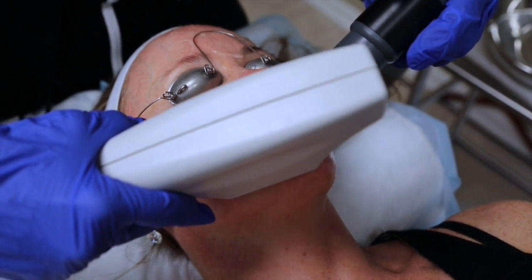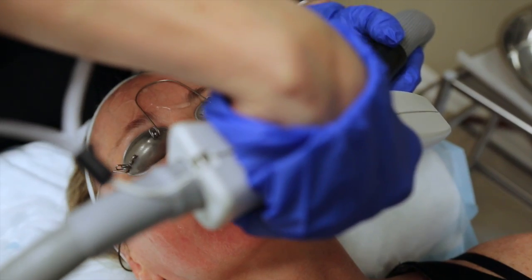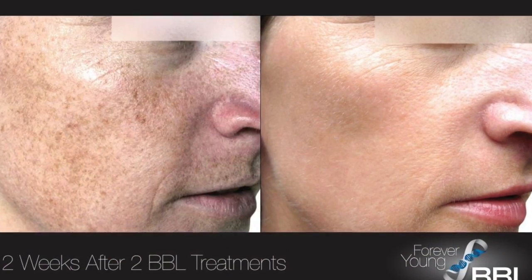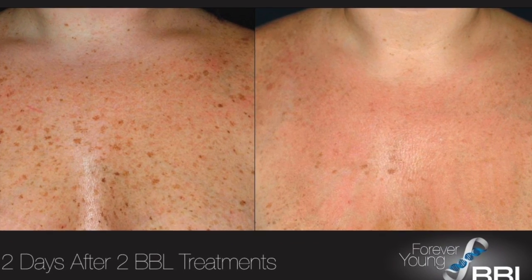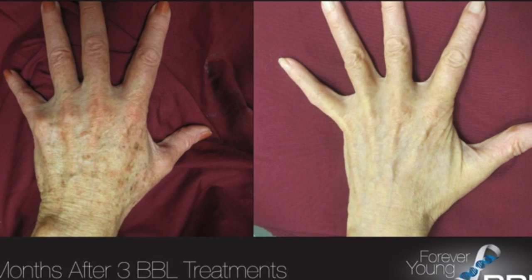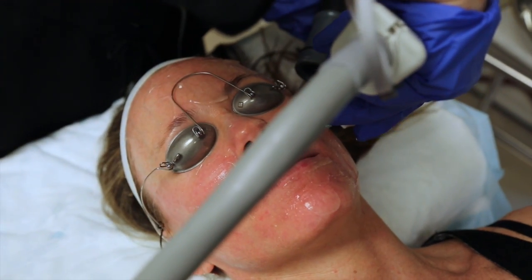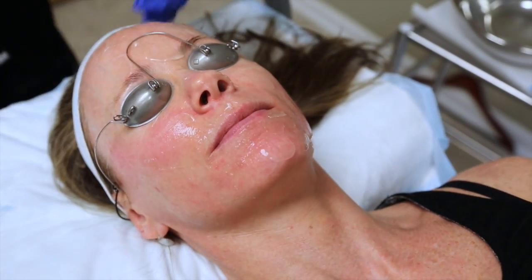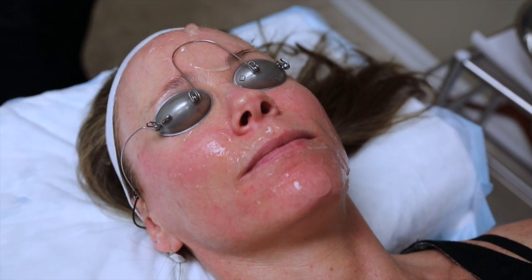So the first filter I use is actually looking for any browns in her skin. Let's see, it will be absorbed into the brown pigment. We'll heat it up, cause a little bit of injury, and then the body goes in and starts to clean up the mess. So what typically happens, she doesn't have a lot of pigmentation in the skin, at least not on her face. So she should not have a lot of speckling, which happens with some people who have a lot of sun damage.